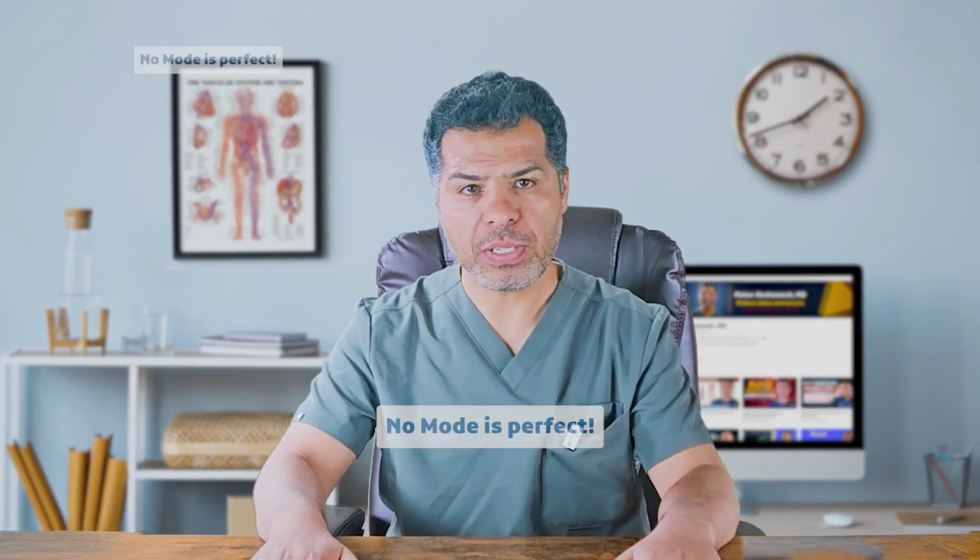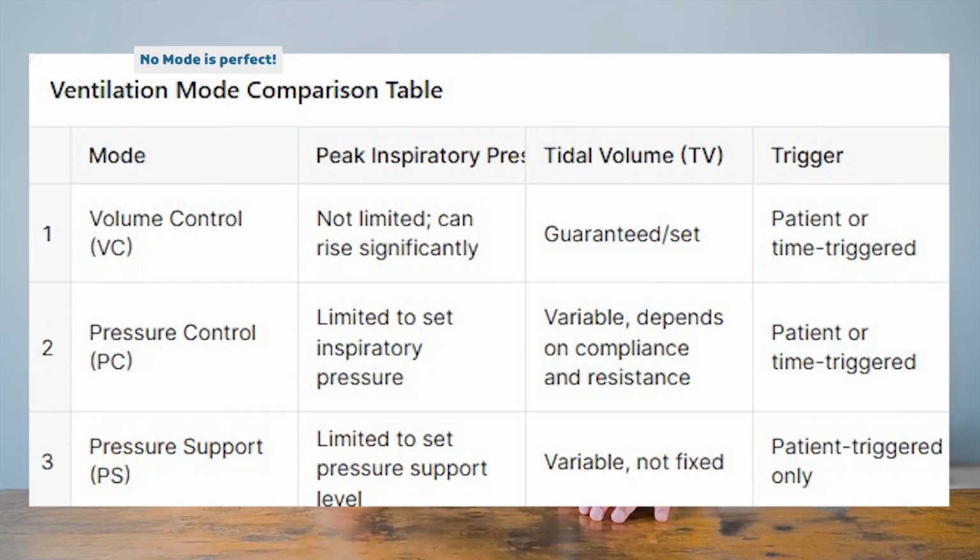No mode is perfect. Each mode has its advantages and limitations. For example, in volume control VC mode, you are guaranteed a set tidal volume, but there is no limit on how high the peak inspiratory pressure can go. While in pressure control mode, the PIP, the peak inspiratory pressure, is controlled and won't exceed the set level, but the tidal volume can vary from breath to breath depending on the lung compliance and resistance. And pressure support mode, which is typically used for weaning, functions similarly to PC pressure control mode. It limits the PIP but does not guarantee a fixed tidal volume.